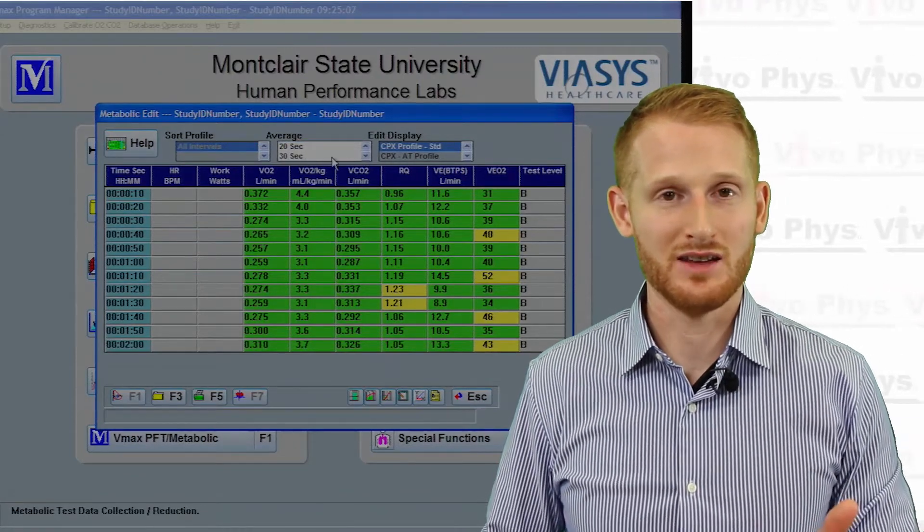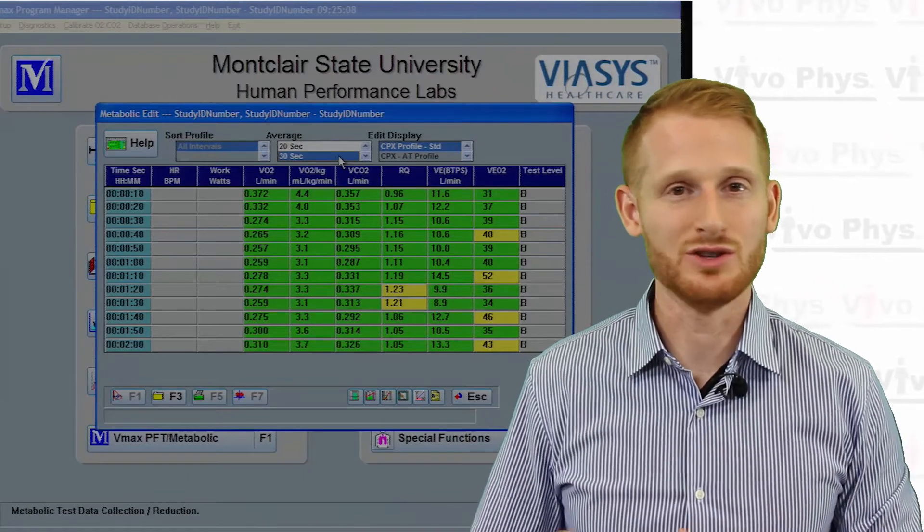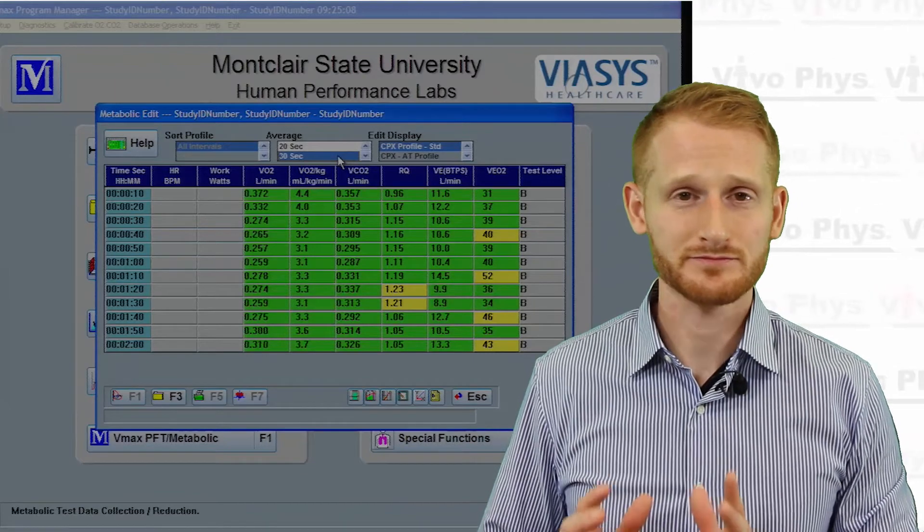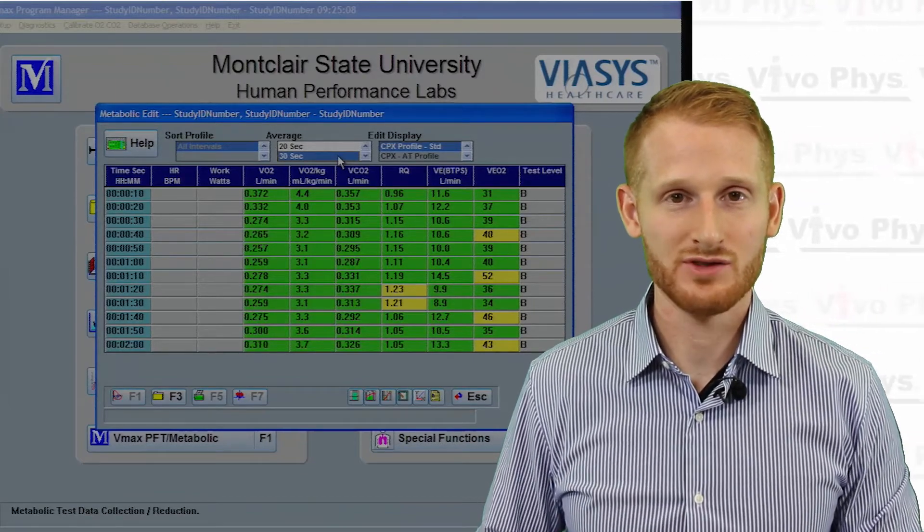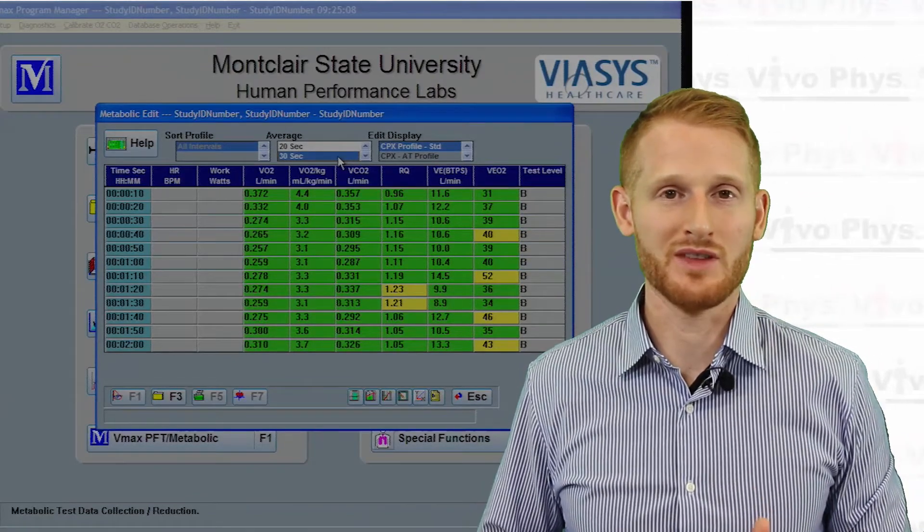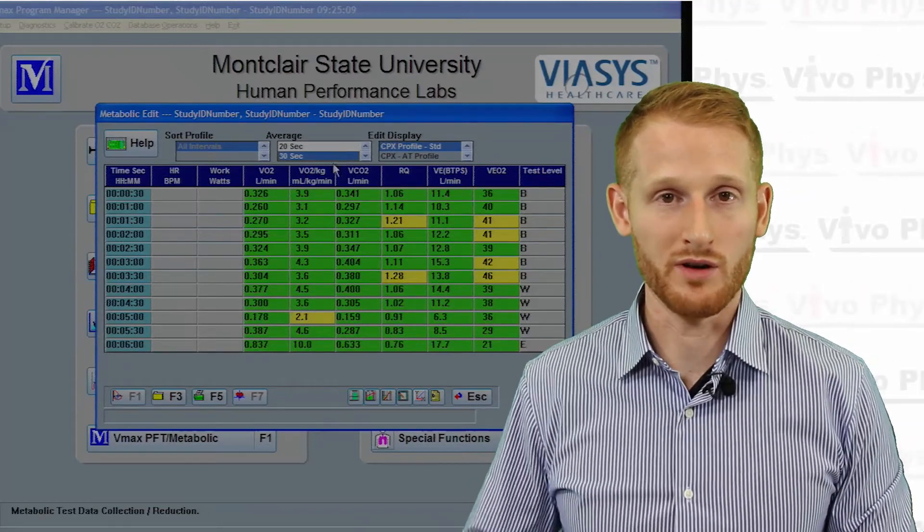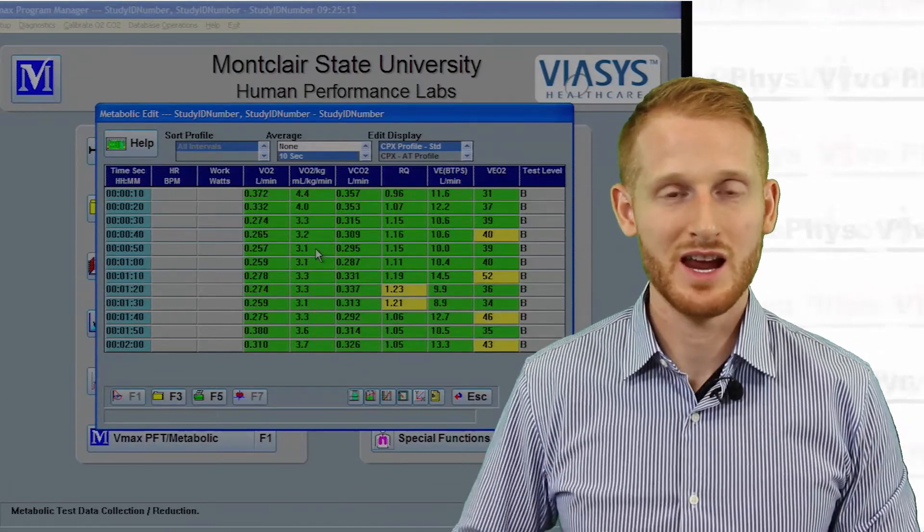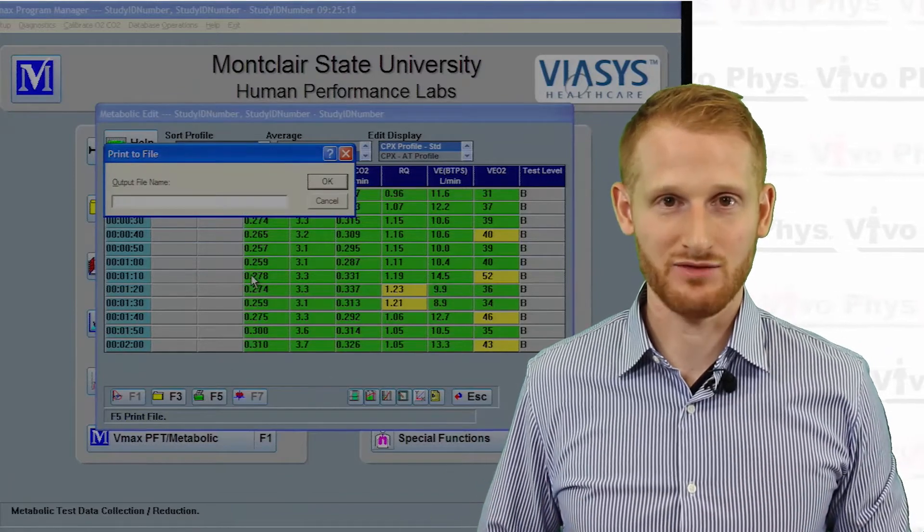It's set to breath-by-breath data initially, which is going to be very noisy—there's going to be a lot of very high and very low numbers and it's not very accurate. What you're going to want to do is change it to be either 10-second averages or 30-second averages. 10 seconds is generally enough, but sometimes you want something that is very stable, so 30 seconds. Click on one of those averaging options and then just hit print.